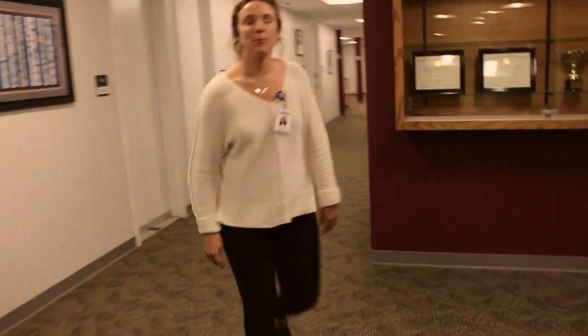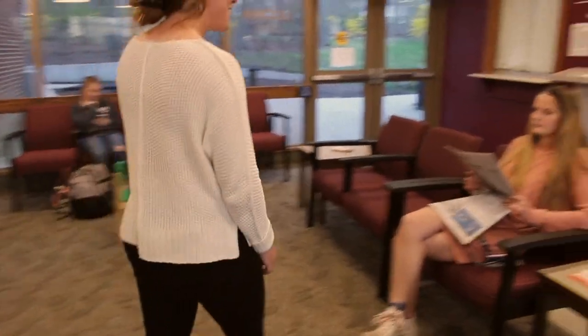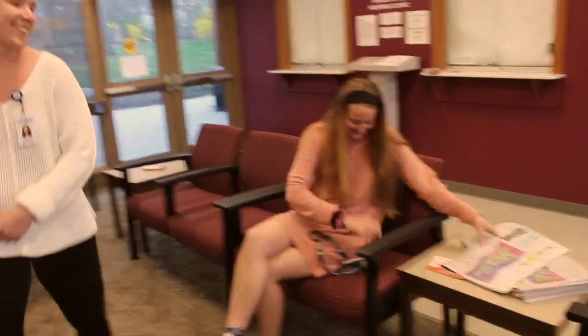Our patient today's name is Maura. She's been experiencing a lot of difficulty listening in noise. So I think what we're going to do today is test out her hearing aids and make sure that the directional microphone that we programmed is working appropriately. Let's go get her. Hey Maura. Hi! You ready? I am ready. Let's go.